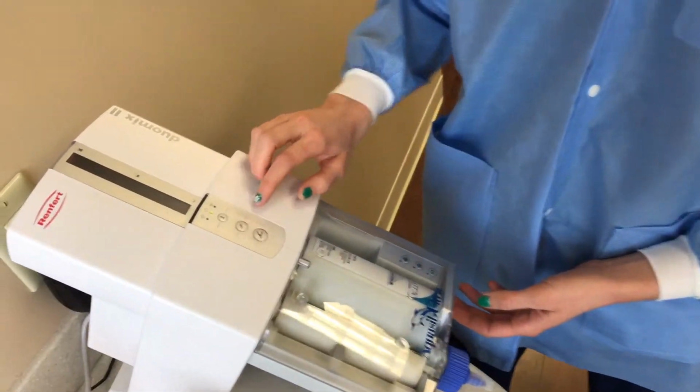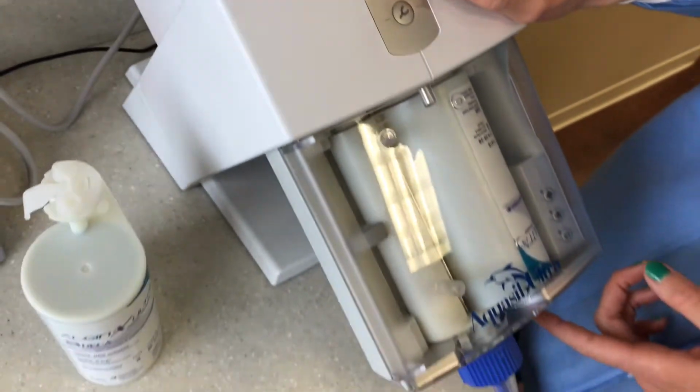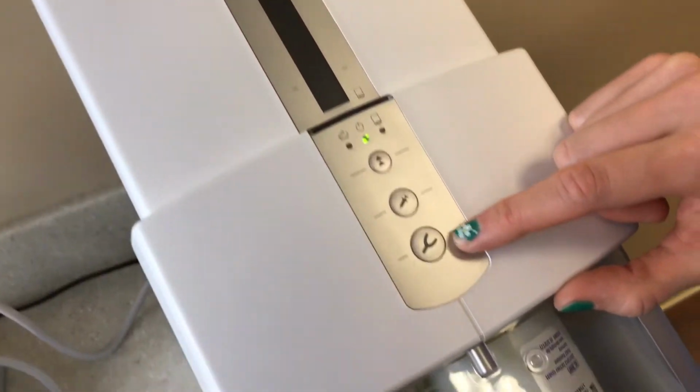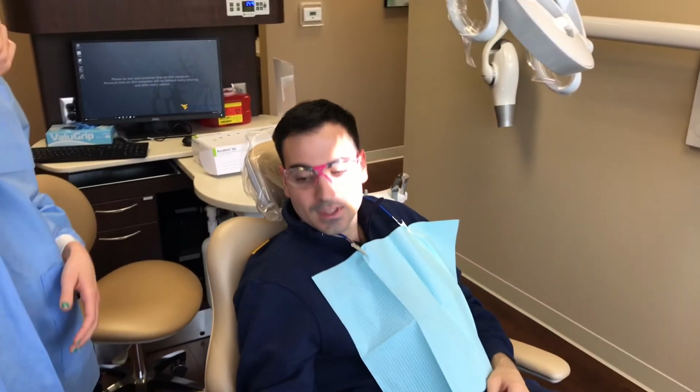And we have two settings here. The first has a picture of a syringe, so we can insert a syringe down at the tip. This is a slower fill. And this, as you see the tray or the wishbone setting, this is a faster or turbo mix setting that will allow us to fill an entire tray very quickly and then insert in the patient's mouth. And we're going to do a live patient demonstration today.